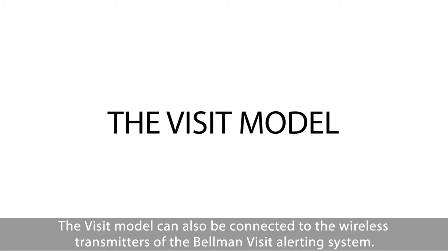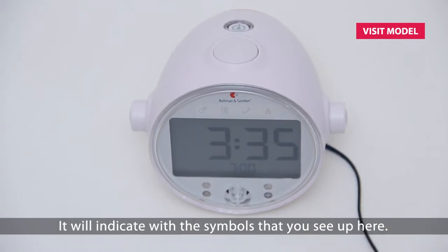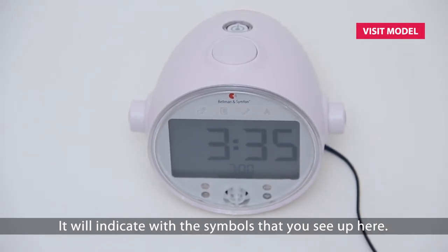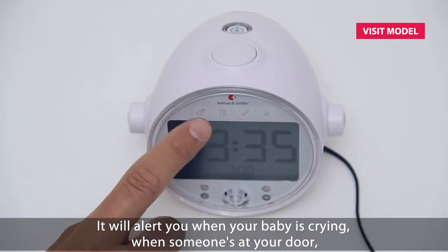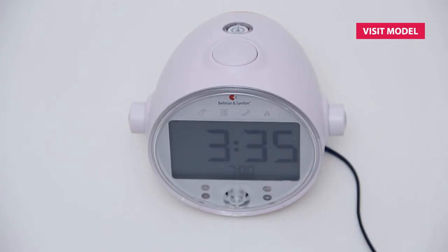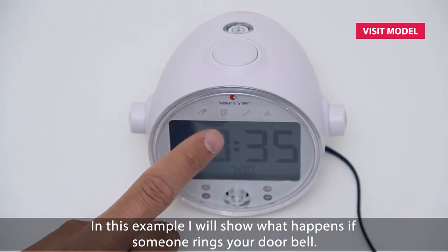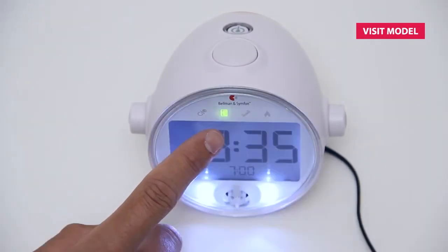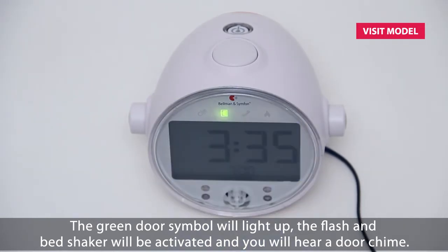The VISIT model can also be connected to the wireless transmitters of the Bellman VISIT alerting system. It will indicate with symbols on the display. It will alert you when your baby is crying, when someone's at your door, when the telephone rings, or even if the smoke detector is activated. The Bellman VISIT transmitters are purchased separately. In this example, I will show you what happens if someone rings your doorbell. The green door symbol will light up, the flash and bed shaker will be activated, and you will hear a door chime.